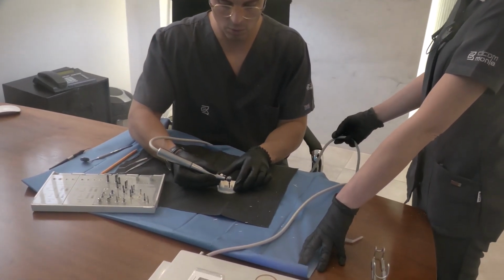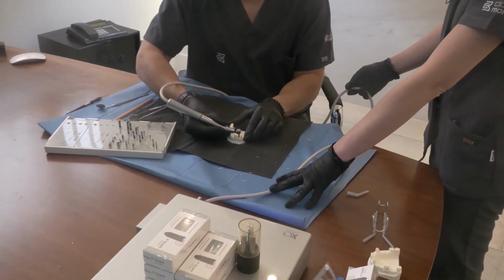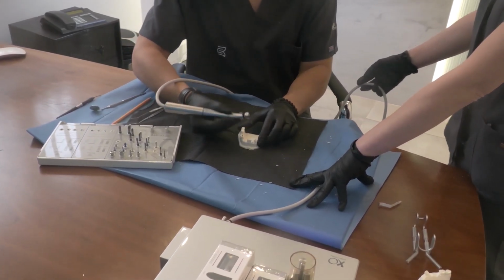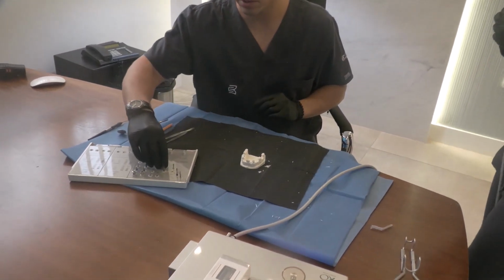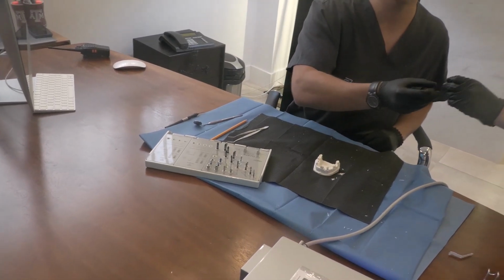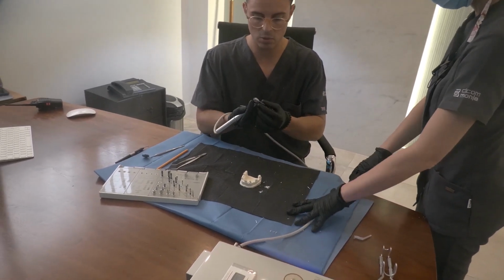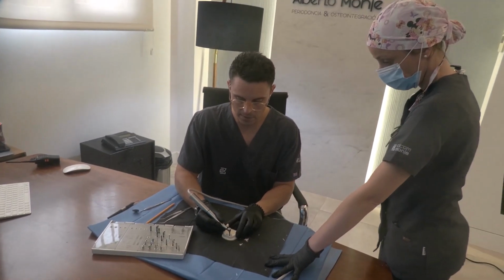So you follow the same protocol, which has been, of course, tested in order to guarantee that there is no overheating while drilling, and that the implant will be inserted with an adequate insertion torque and will be achieving adequate primary stability, but not very, very high because it's not really desired, considering that the implant is a parallel wall dental implant.